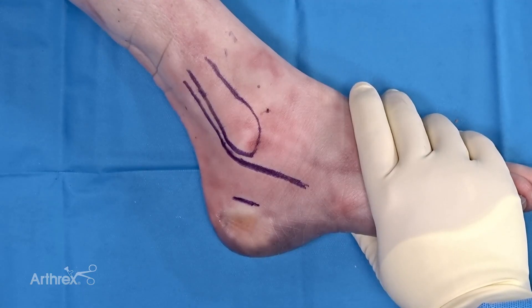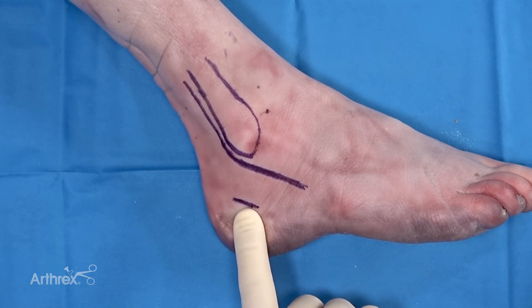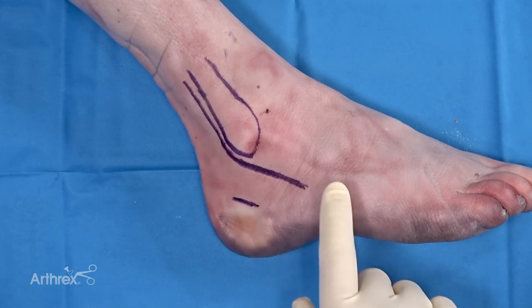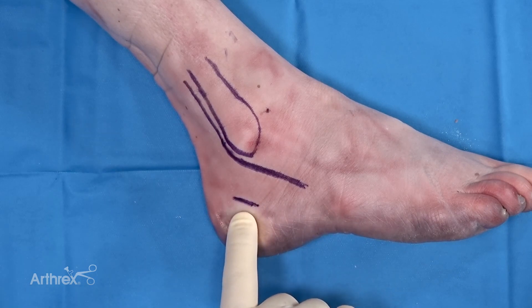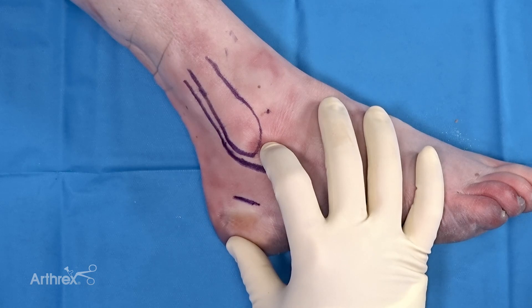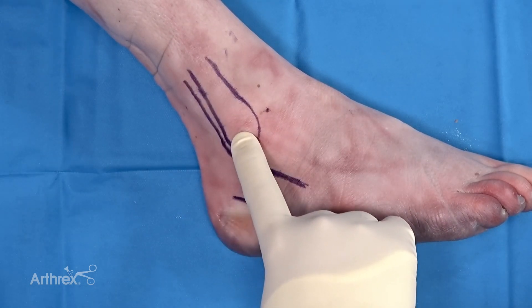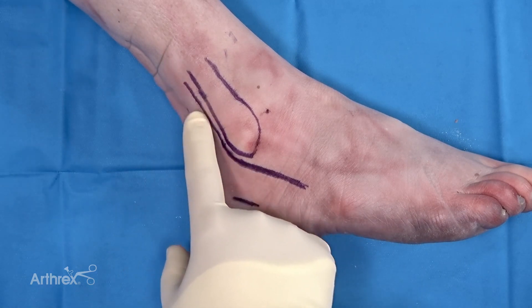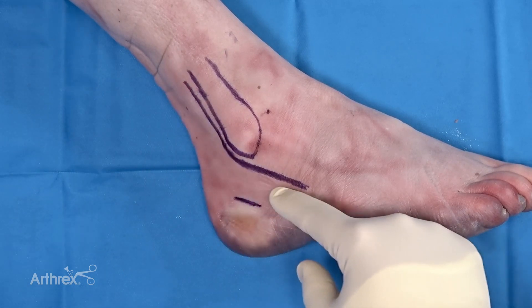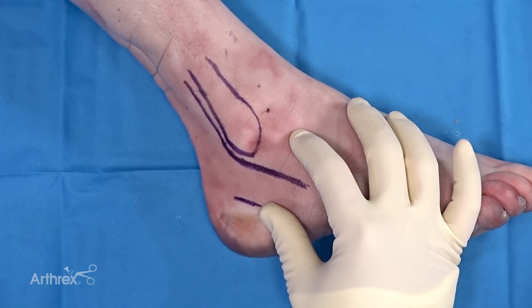For today's demonstration we are going to be obtaining the morselized autograft from the calcaneus. The harvest site can be identified either with fluoroscopy or just by palpating landmarks on the hind foot. Be aware that the fibula and the peroneal tendons run posterior and inferior, and you definitely want to avoid getting into those tendons during your harvest.